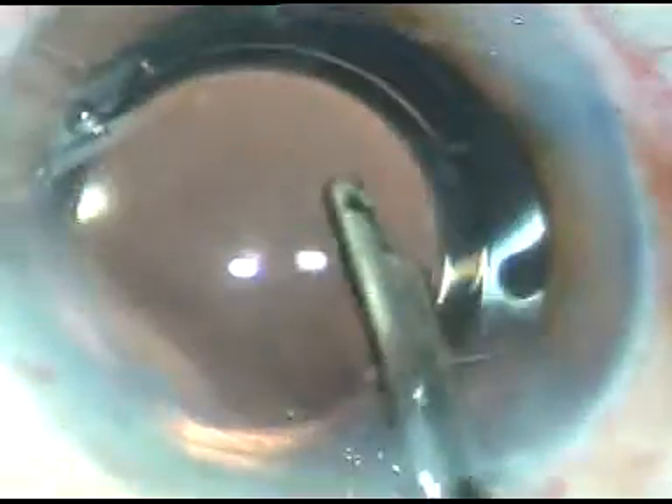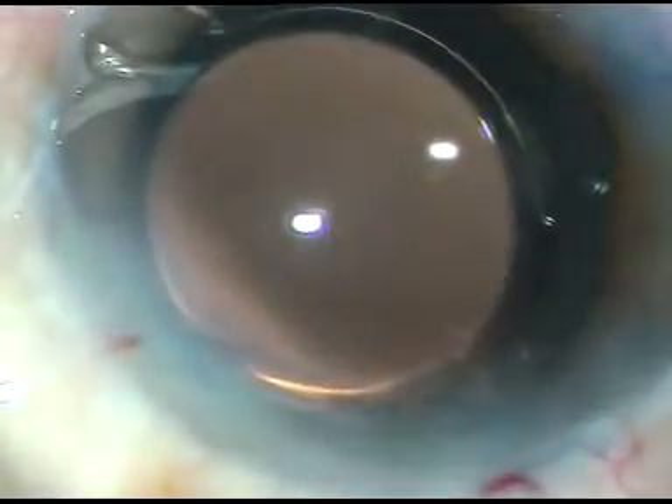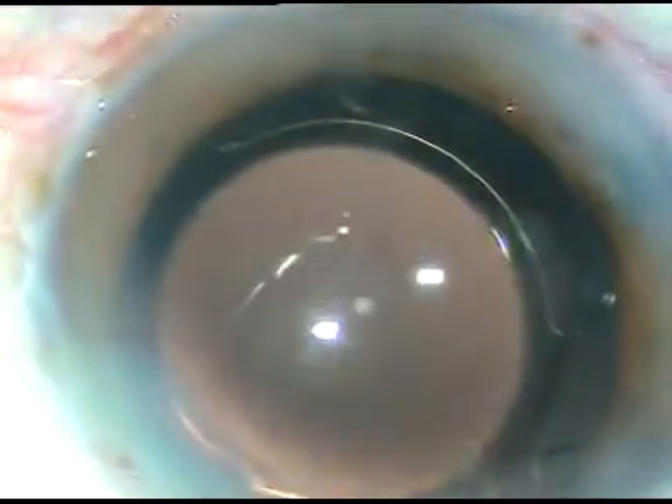So the aim of this video is to emphasize the importance of turning the tip — turning the bevel towards the nuclear fragments, towards the epinucleus, towards any lens matter. Followability of lens matter increases dramatically if we turn the tip towards the lens matter. The case is done. Thank you very much for watching. Hope this video will help you in your practice.